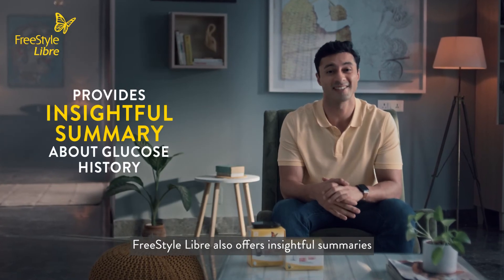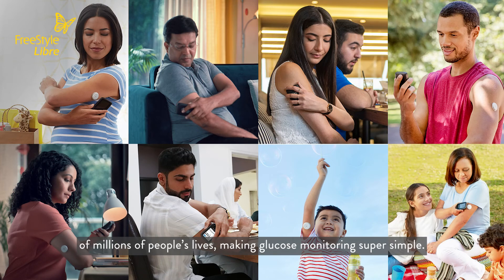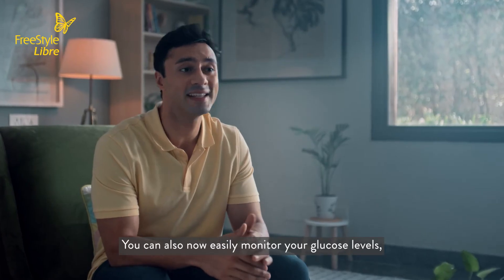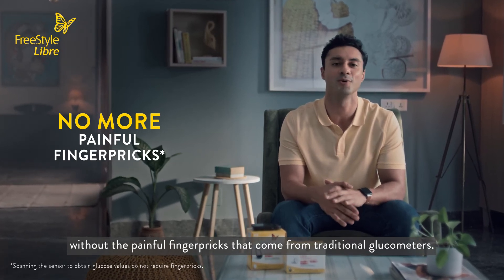Freestyle Libre also offers insightful summaries about your glucose history. Today, Freestyle Libre has seamlessly become part of millions of people's lives, making glucose monitoring super simple. You can also now easily monitor your glucose levels without the painful finger pricks that come from traditional glucometers.